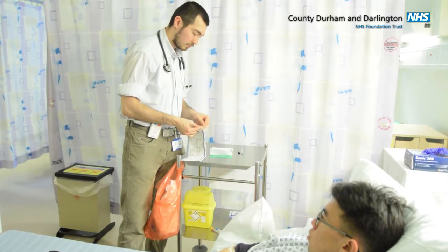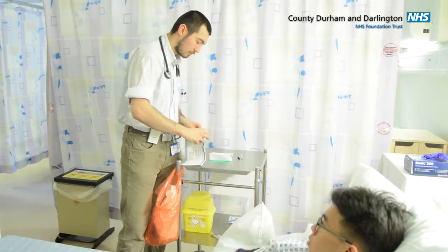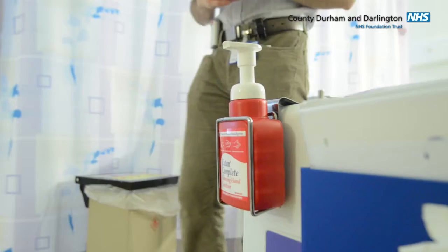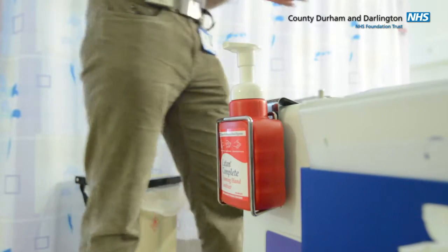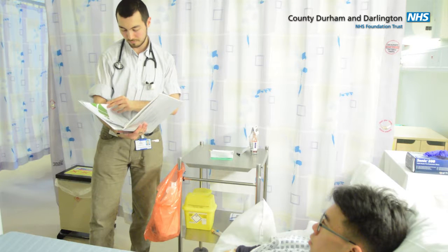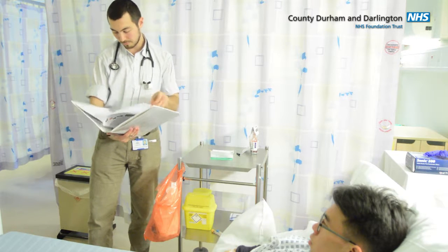Document in the patient's notes the rationale of why the procedure was performed, including the date, time, lot numbers of the blood culture bottles used, the site of venipuncture, and if any complications were encountered. Please don't use the sticker on the bottles, as this is used in the pathology lab.